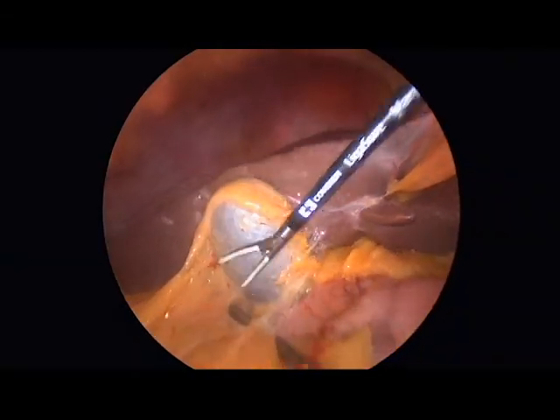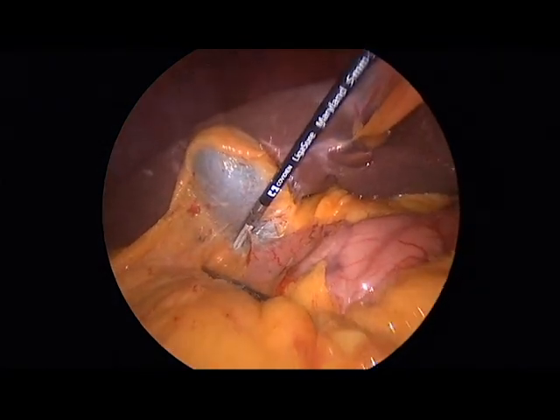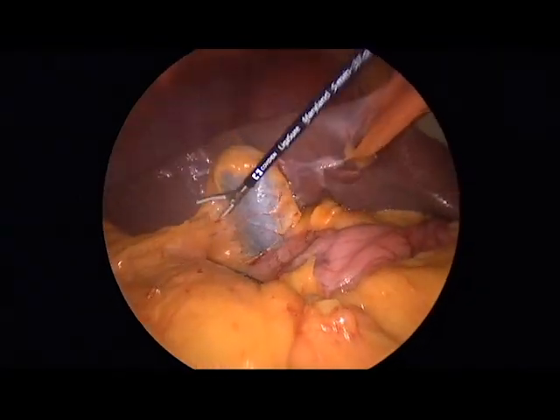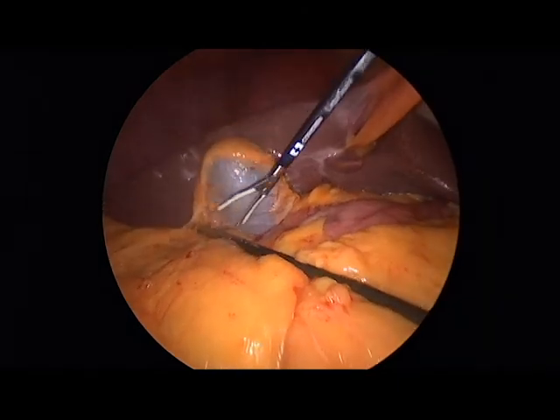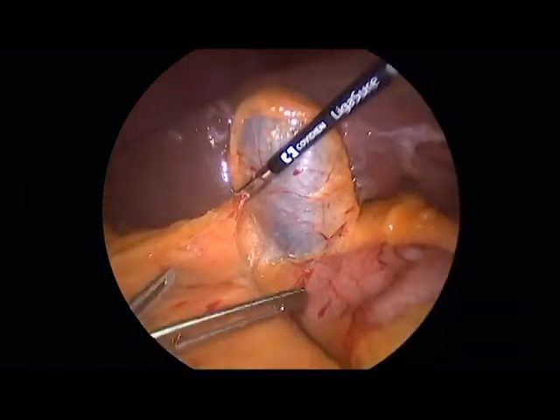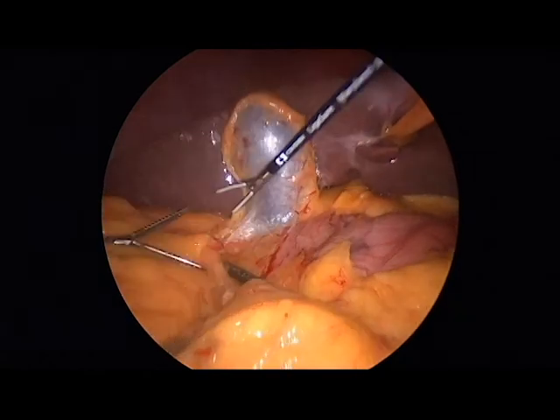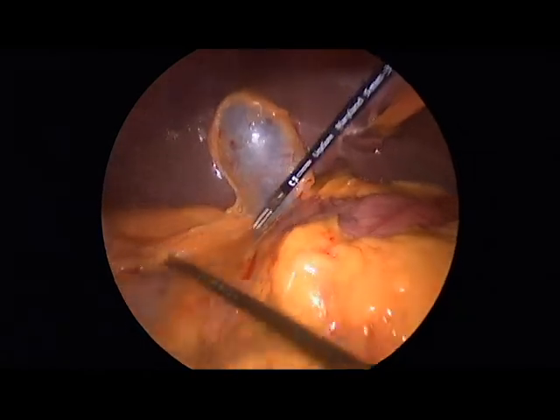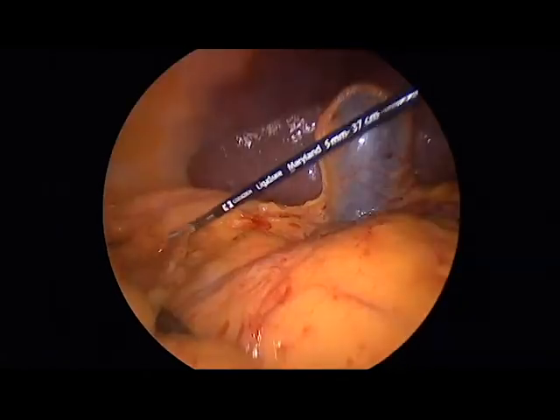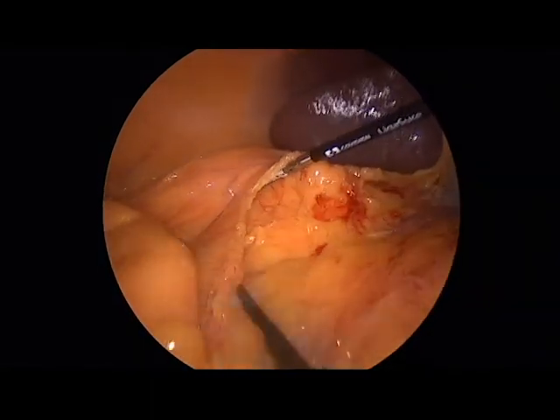Dissection is then commenced in the supracolic compartment. Note the inflammation leading to adhesions near the gallbladder from recurrent episodes of pancreatitis and/or duodenal obstruction. The hepatic flexure is taken down widely to facilitate later Kocherization, and this can be seen here.